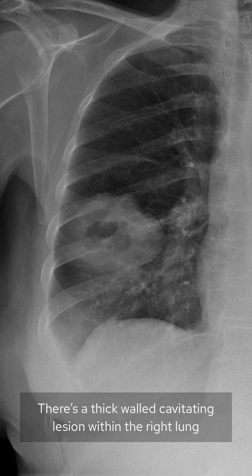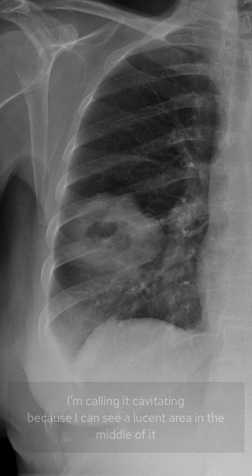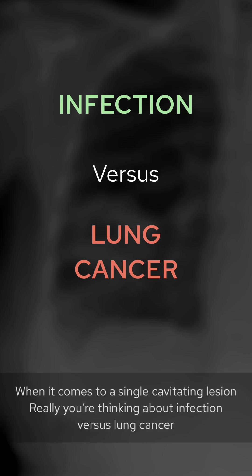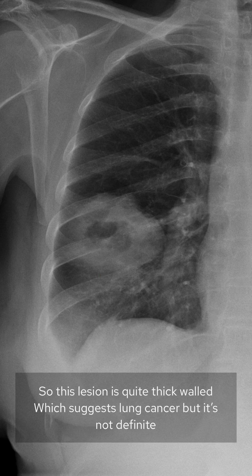There's a thick-walled cavitating lesion within the right lung. I'm calling it cavitating because I can see a lucent area in the middle of it. Although the differential for multiple cavitating lesions is wide, when it comes to a single cavitating lesion, you're really thinking about infection versus lung cancer. This lesion is quite thick-walled, which suggests lung cancer, but it's not definite.